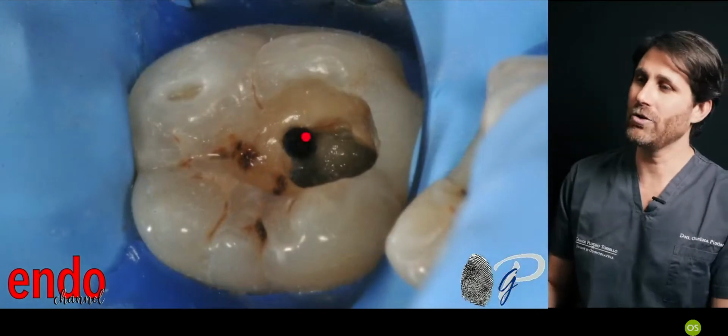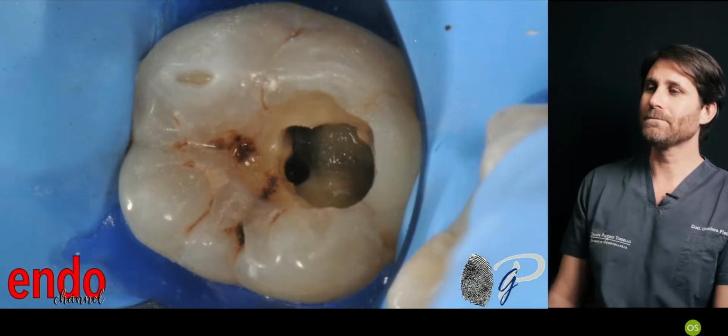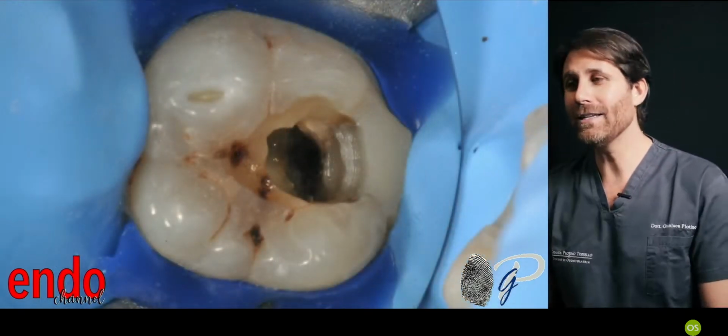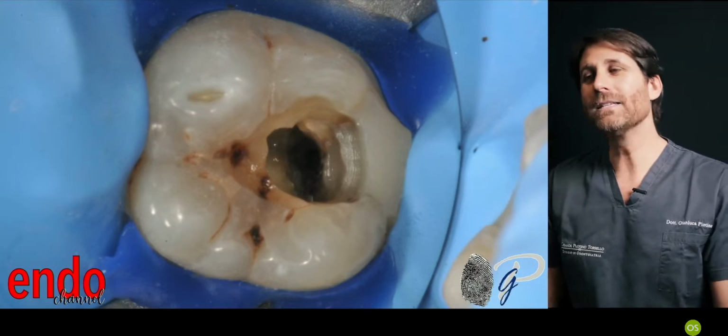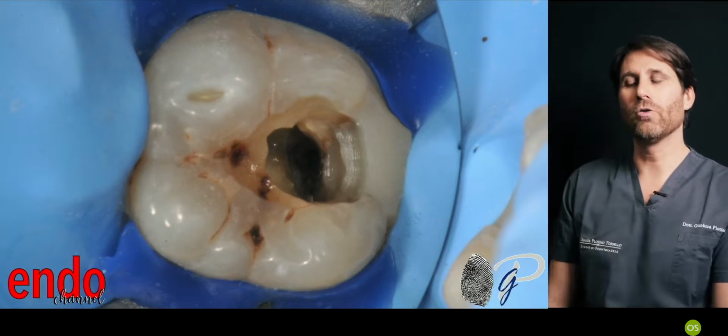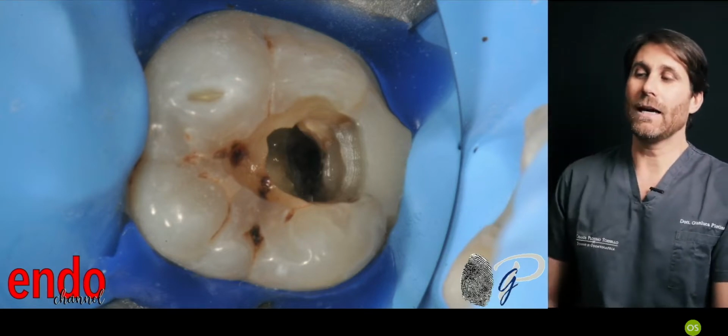This is the preparation of one of the mesial root canals. This is the preparation of the other mesial root canal. And this is the preparation of the distal root canal. So a distalized access is very difficult. Not always can we be so conservative in maintaining the tooth structure because of difficult access to this area.